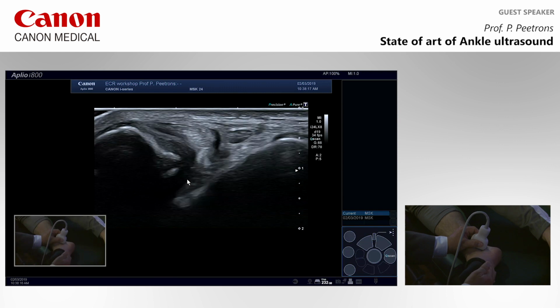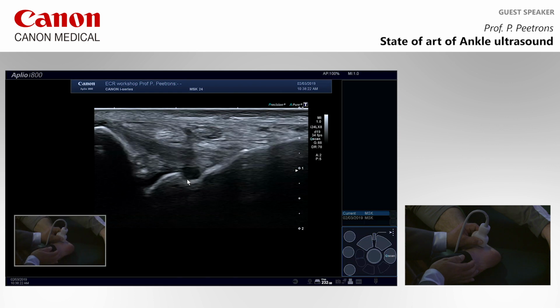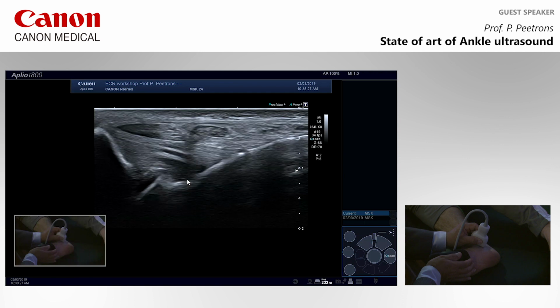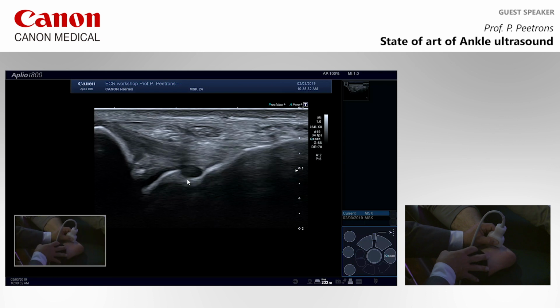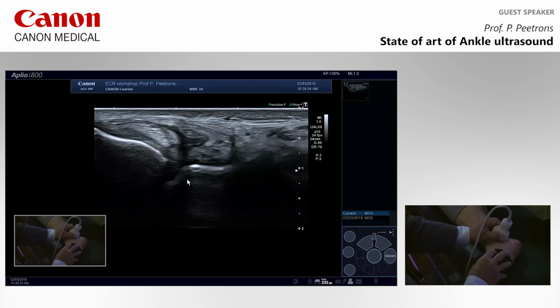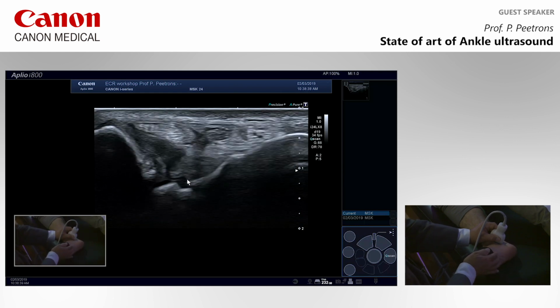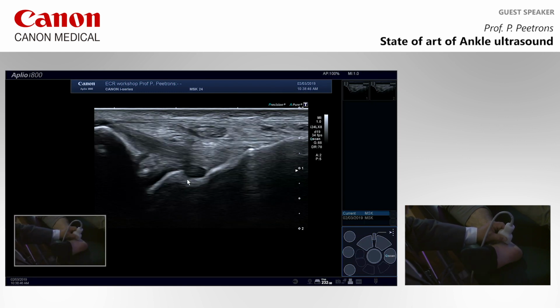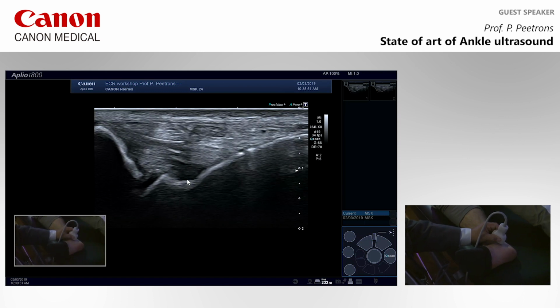But if I do this, I stretch the ligament, and you see that there is no gap at all. The ligament is complete, and he has no lesion of the deltoid ligament. Okay? So very important: stretching position and non-stretching position. The tibia and the talus are close to each other. The tibia and the talus are far from each other. And when they are far from each other, you can see this posterior part of the deltoid ligament very clearly. Okay? So this is very important.